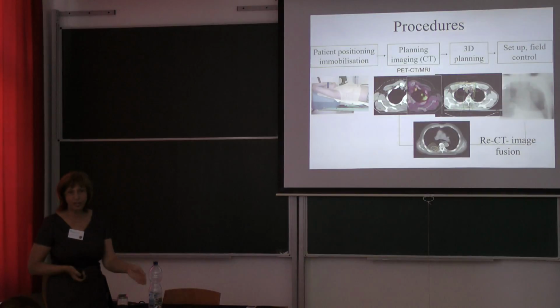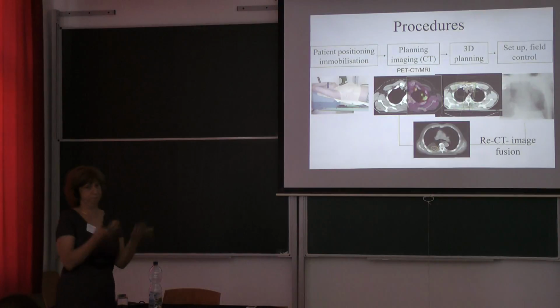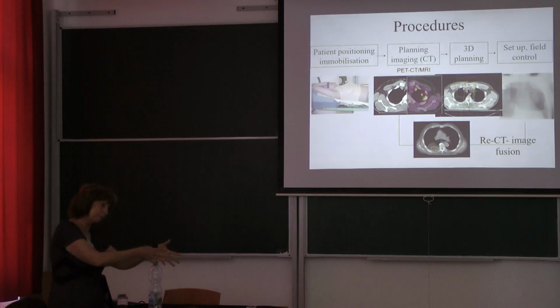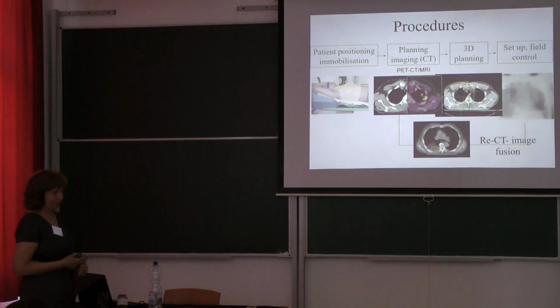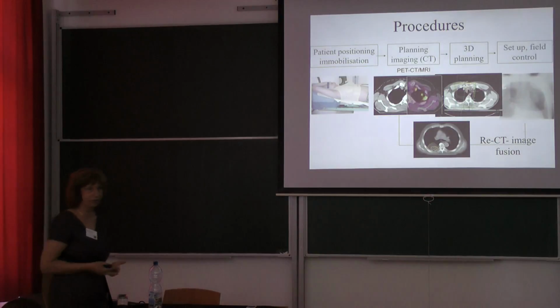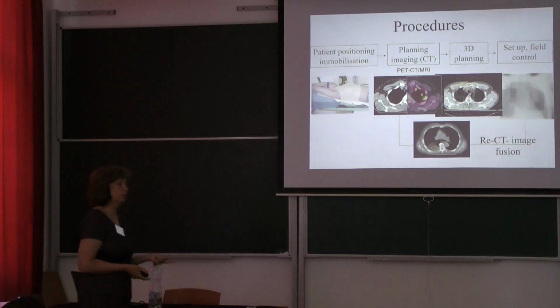And each day the patient should be in the same position as it was planned. We have one plan and we have to put the patient exactly as it was planned. This is one problem. The other problem is that everything can change within the body of the patient. During the radiation, there is a swelling in the treating region.